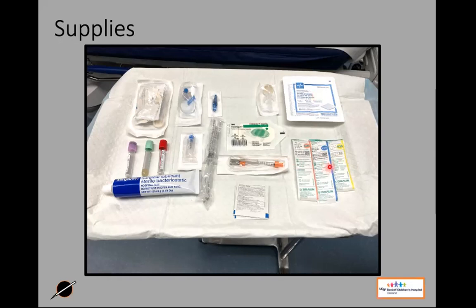And then we also have our Jtip here in the middle, and I'm going to advocate for trying that out. I know people are a little bit hesitant to use the Jtip and the buffered lidocaine. Sometimes when we're using it on our superficial blood vessels, because it's in such close proximity to that blood vessel, we get a lot of vasoconstriction, or even people blow the vein. With the ultrasound, we're looking at vessels that are running a little bit deeper. So when we use the Jtip, we're blowing the buffered lidocaine underneath the skin. It's further away from that blood vessel.